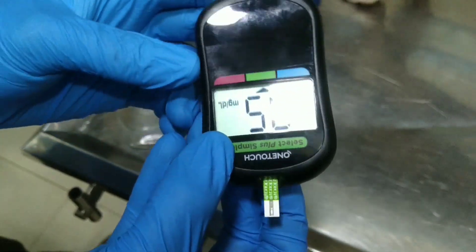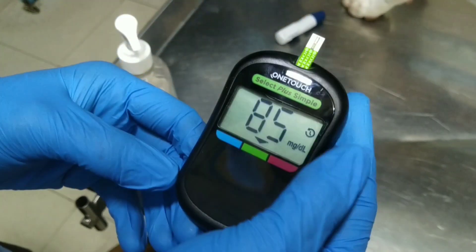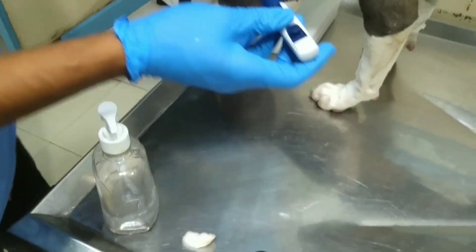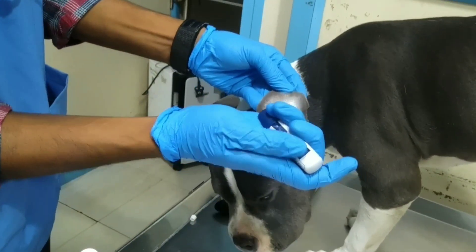When we insert the strip, the glucometer turns on automatically. Check the value — this symbol shows that the machine is ready to check.